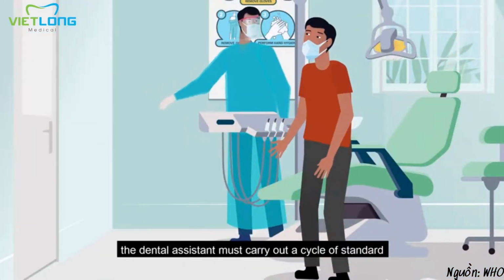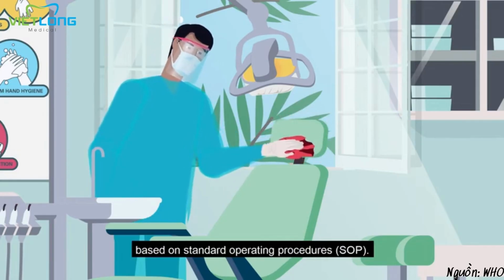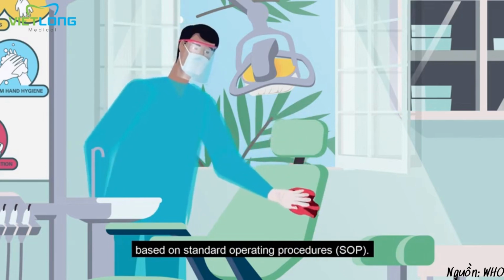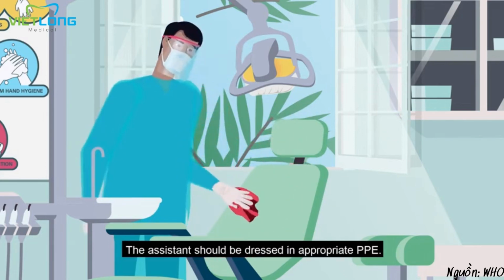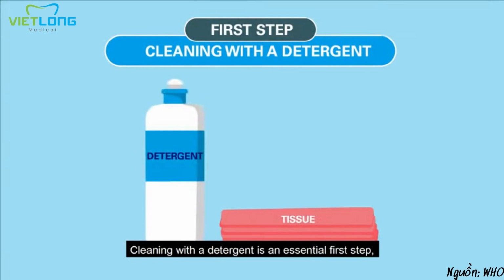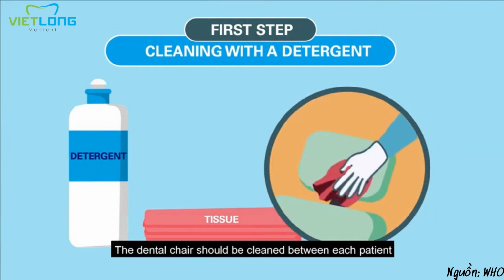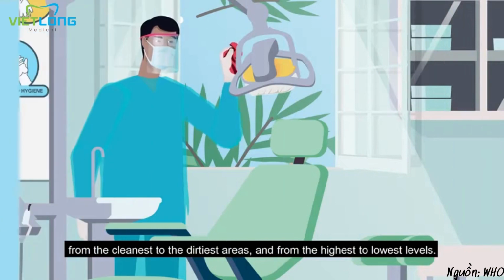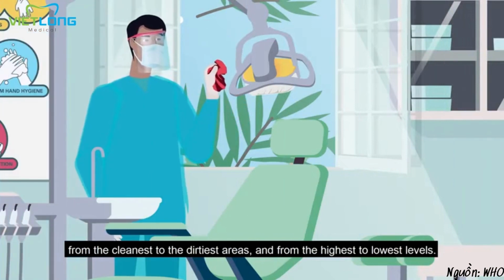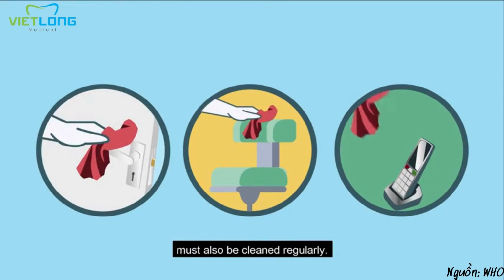After every patient, the dental assistant must carry out a cycle of standard cleaning and disinfection based on standard operating procedures, SOP. The assistant should be dressed in appropriate PPE. Cleaning with a detergent is an essential first step, as it helps to remove or significantly reduce pathogens on contaminated surfaces. The dental chair should be cleaned between each patient, from the cleanest to the dirtiest areas and from the highest to lowest levels. High-touch surfaces such as door handles, chairs, phones and desks must also be cleaned regularly.